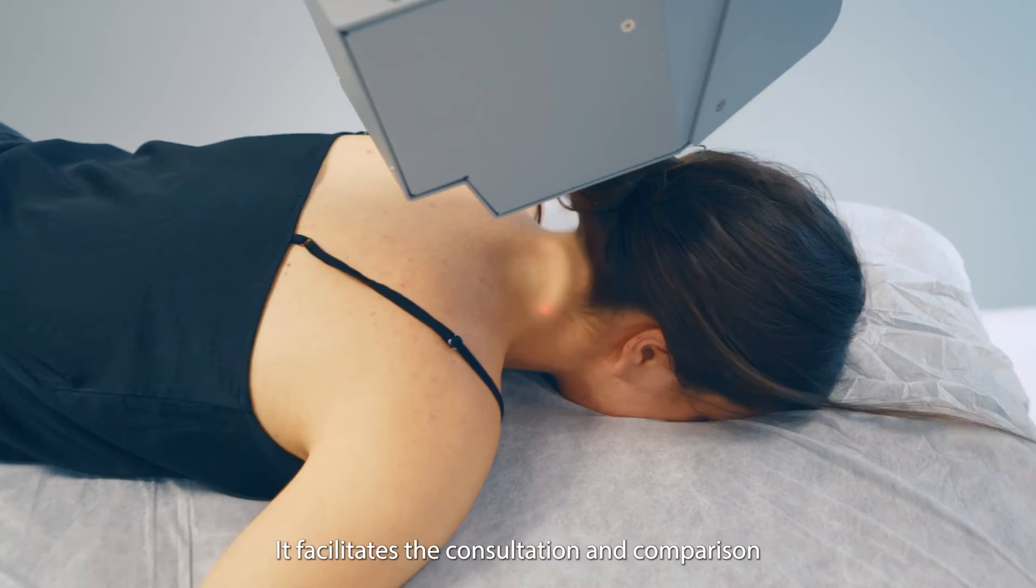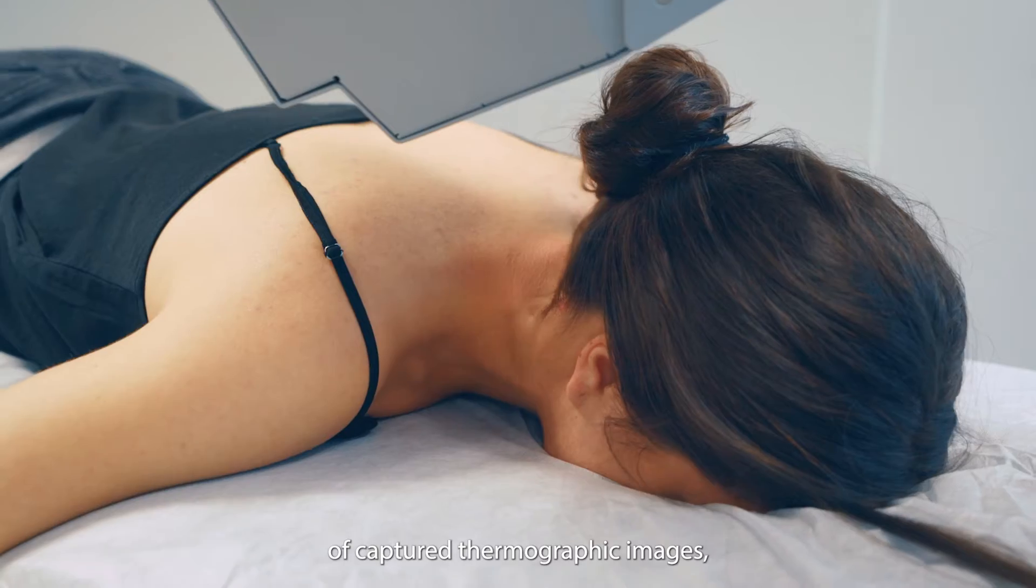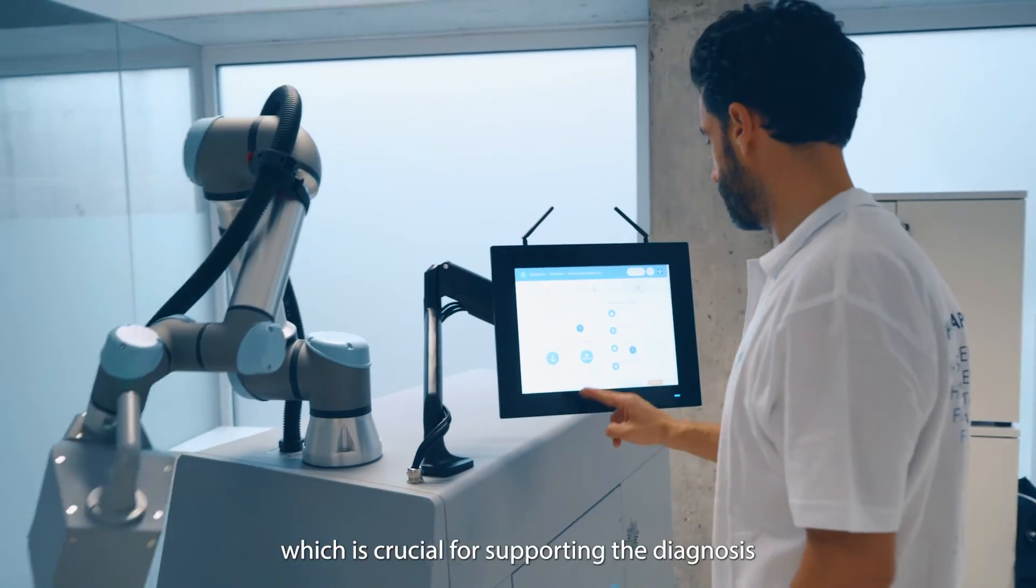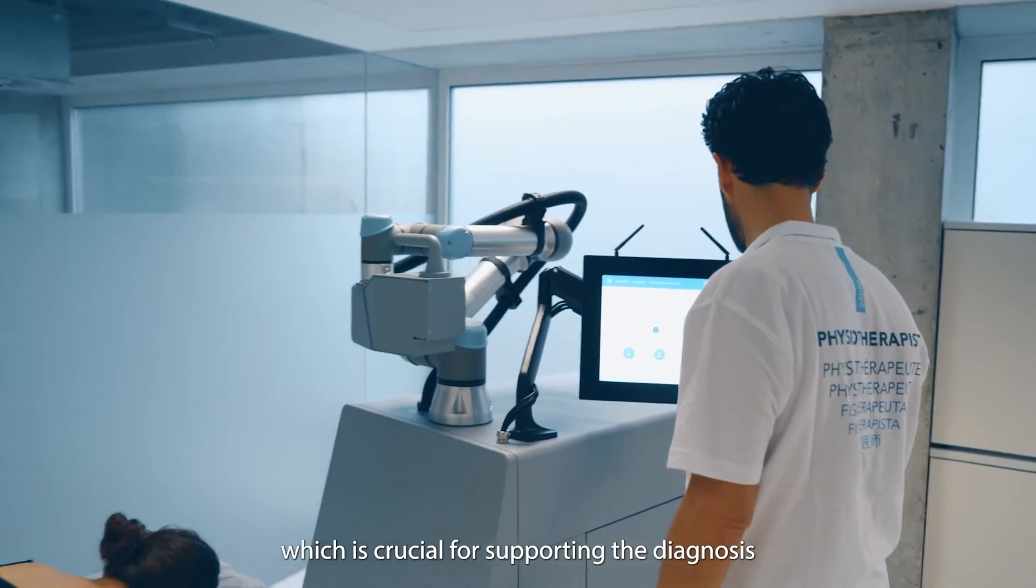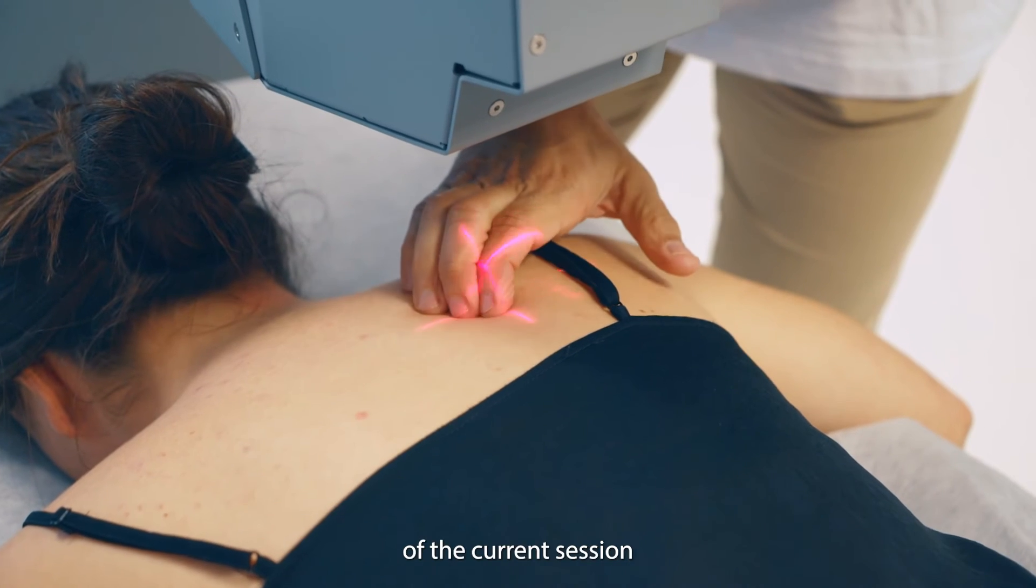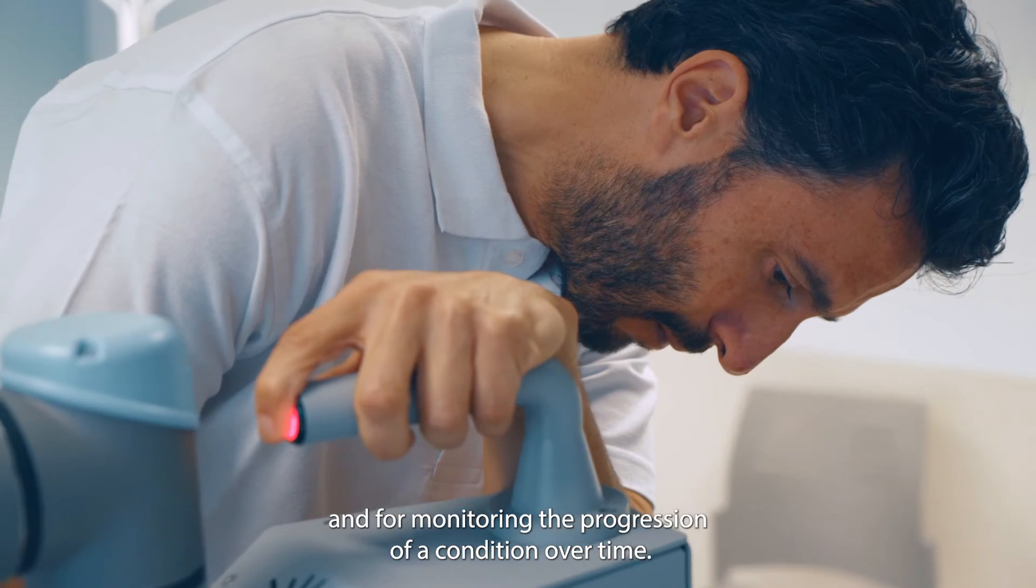It facilitates the consultation and comparison of captured thermographic images, which is crucial for supporting the diagnosis of the current session and for monitoring the progression of a condition over time.